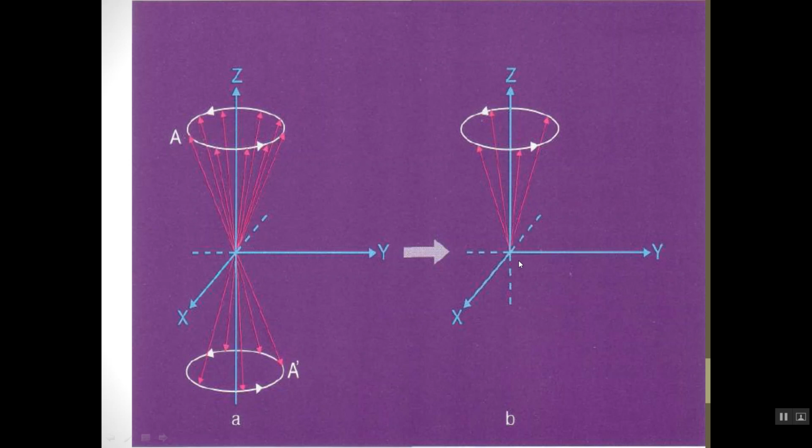It's a very important point to know why we can't detect the signal coming out from the protons in the main field. The proton is a moving magnetic field, increasing the main magnetic field. When I use a radio frequency coil, the magnetic field inside the coil induces current.